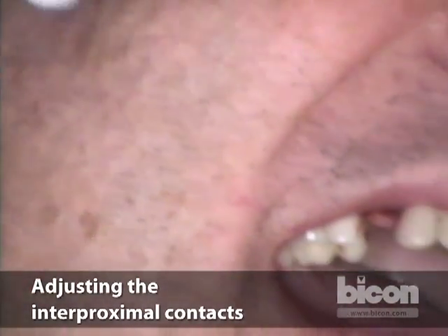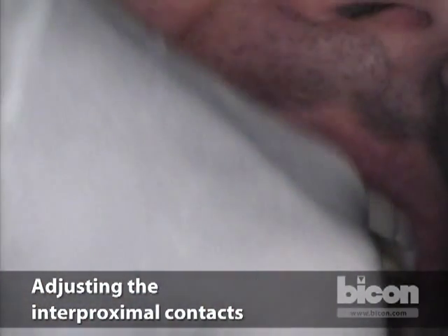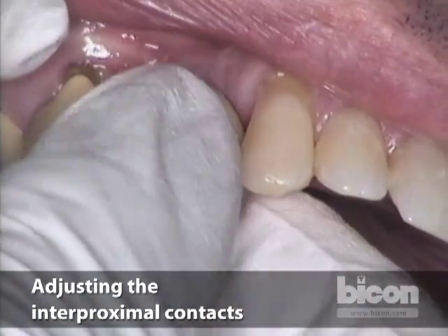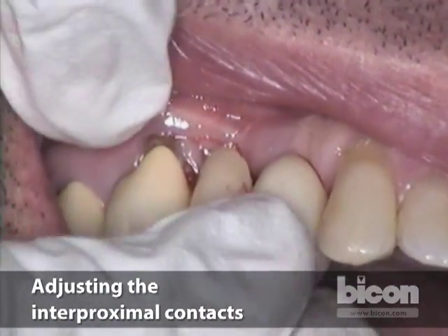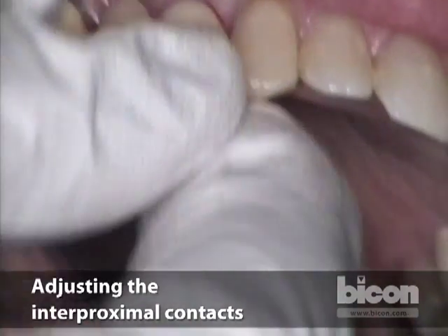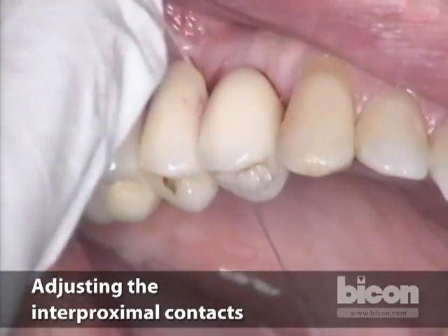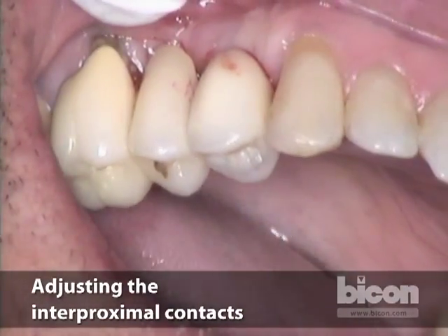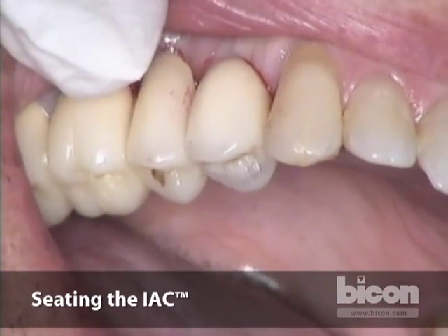I'm going to clean the crown again with alcohol, remove all the excess powder, and then insert it again in the mouth. If the contact is not too tight and the crown is going down again, I have a mesial and a distal interproximal contact. The distal seems a little tight, but not too bad.